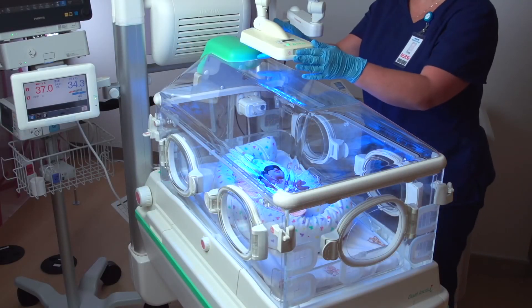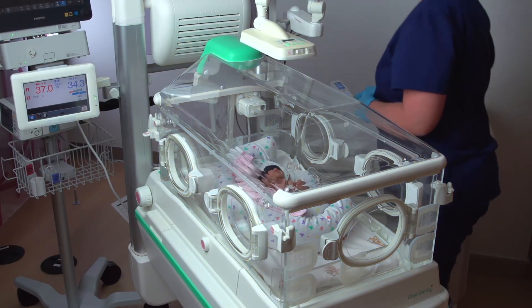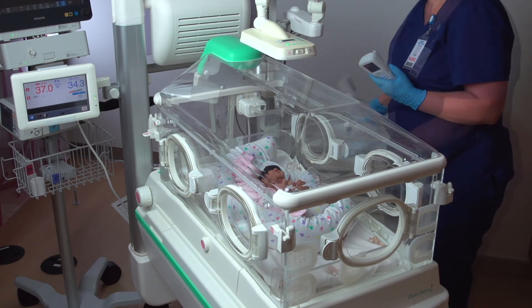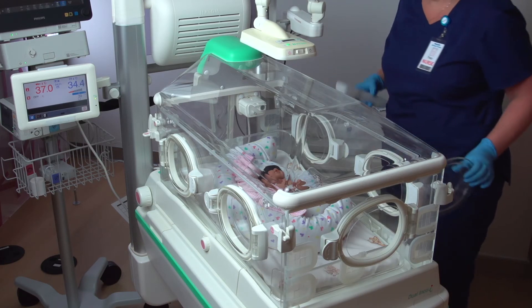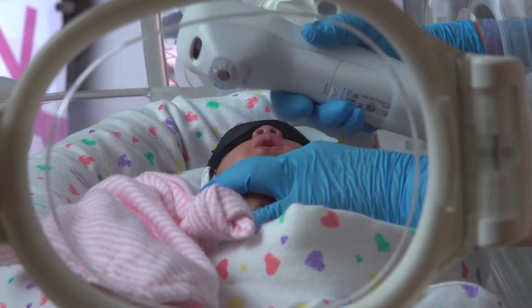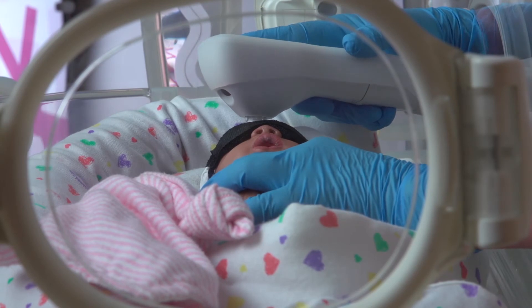The Philips Bilicek Non-Invasive Bilirubin Analyzer is a non-invasive transcutaneous bilirubinometer, which is intended as an index to predict serum bilirubin levels pre-phototherapy, during, and post-phototherapy in neonates.